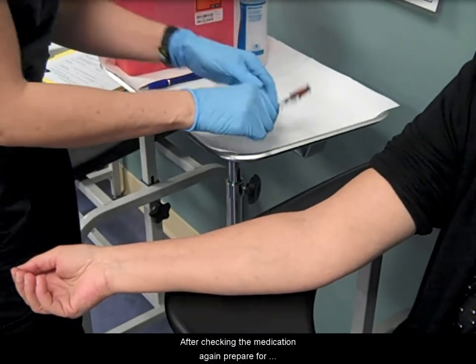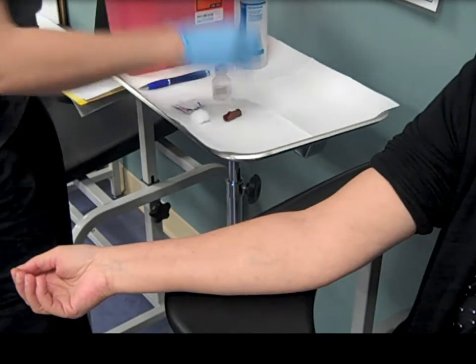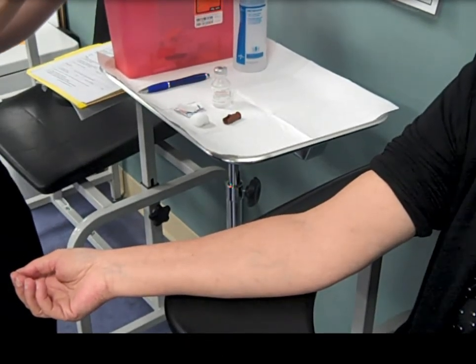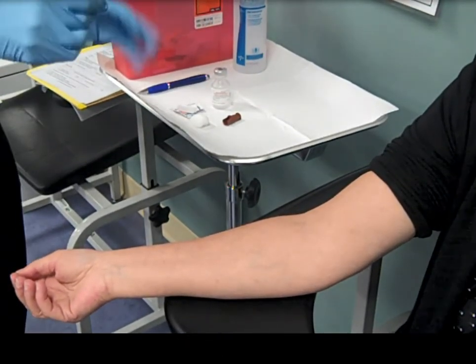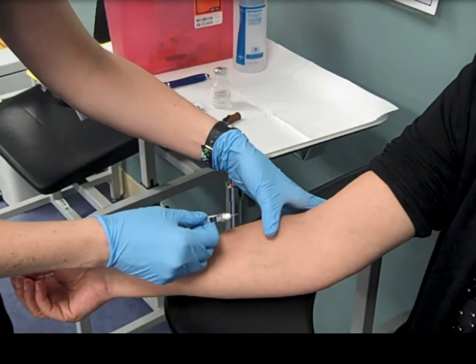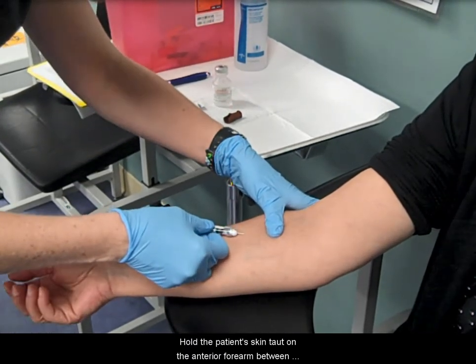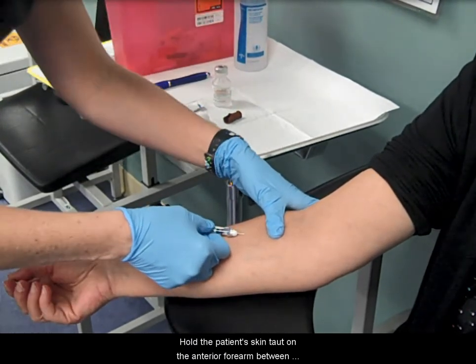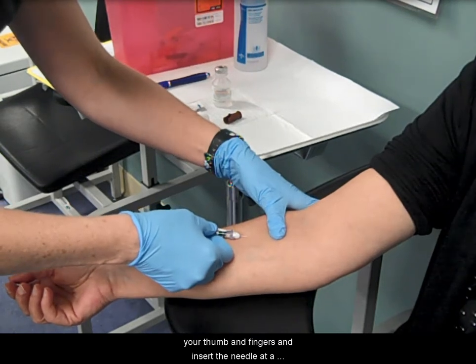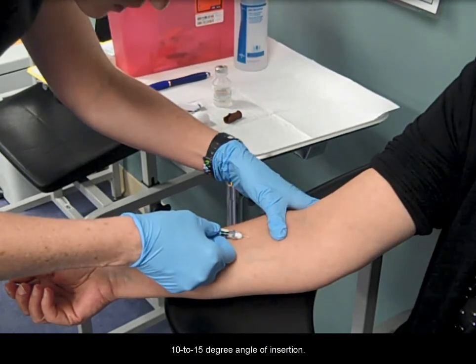After checking the medication again, prepare for administration. Hold the patient's skin taut on the anterior forearm between your thumb and fingers, and insert the needle at a 10 to 15 degree angle of insertion.